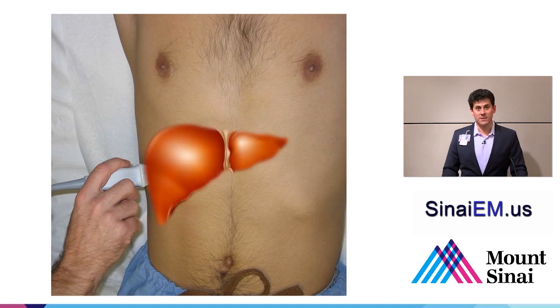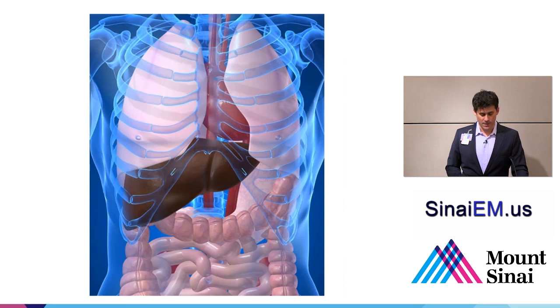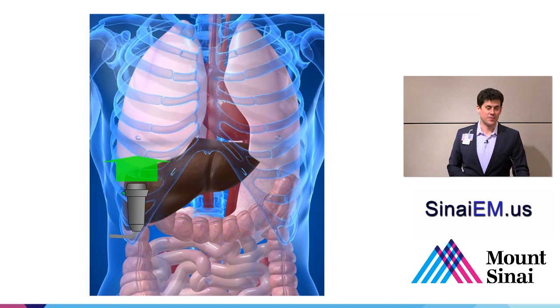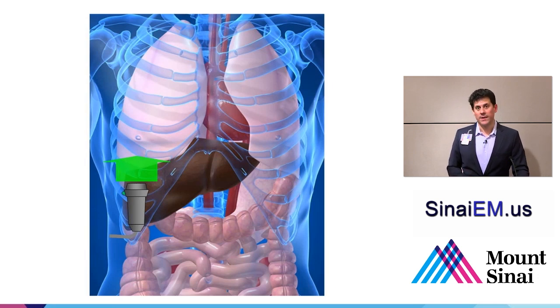Using the liver as a window, which is a lot easier to find — the way I typically do it is start in a transverse orientation, 7 centimeters away from the xiphoid process, with the probe marker towards the patient's right-hand side. Then I'll fan up towards their head, down towards their feet. About 90% of the time you'll find the gallbladder right around that general area, using the liver as a window and typically going in the intercostal space.